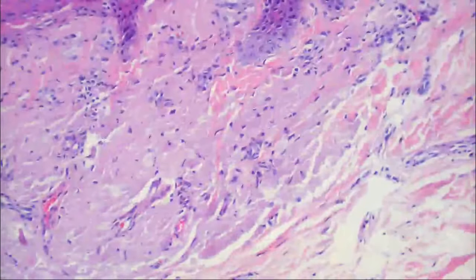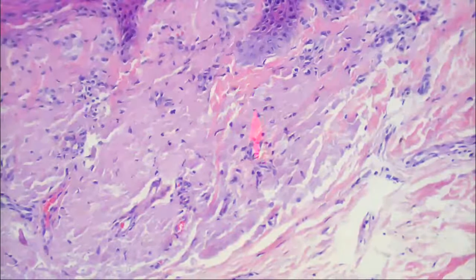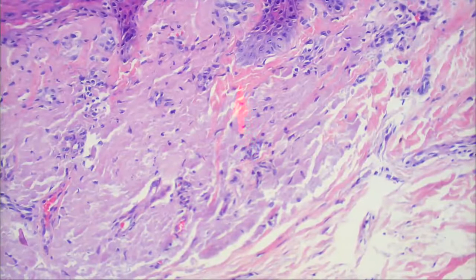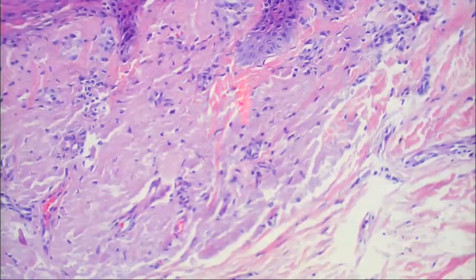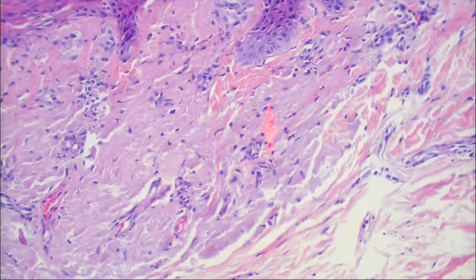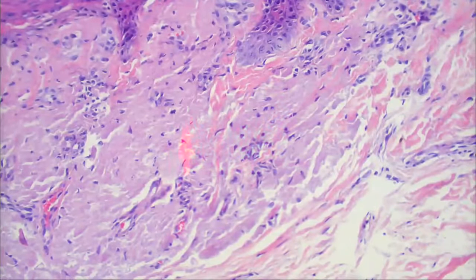Yeah, this is very nice contrast here. This is normal collagen. Look how pink that is. What color is this stuff? Pale pink, or almost kind of a grayish pink. So this is like a nice, bright, hot pink, if you will. This is maybe a little less than regular, normal pink, and this is kind of a grayish color. Grayish pink. So what gives you this? It's also got these small clefts surrounding it.